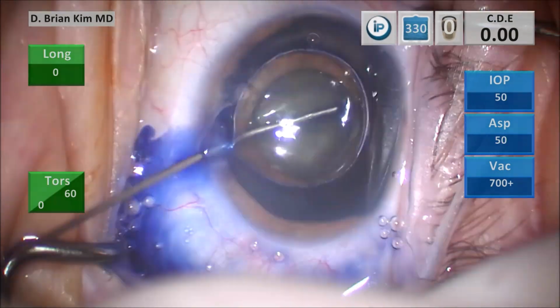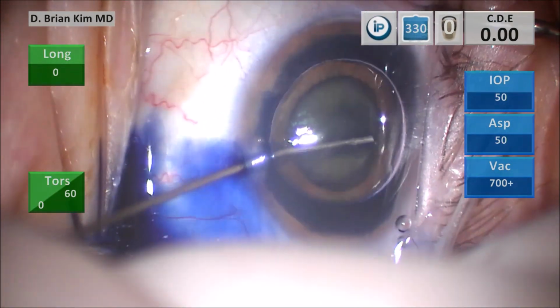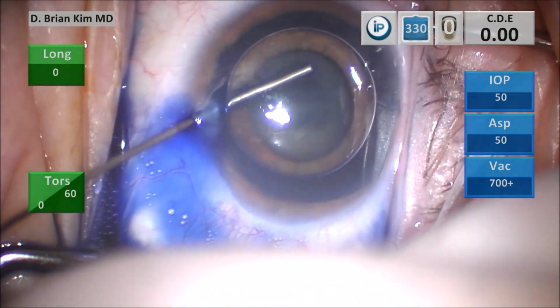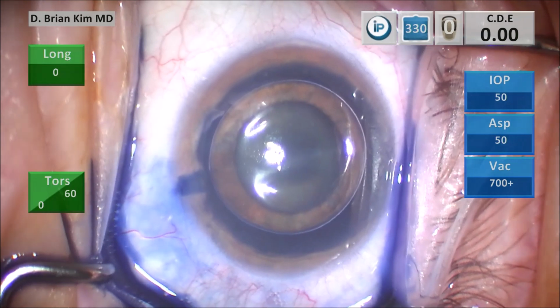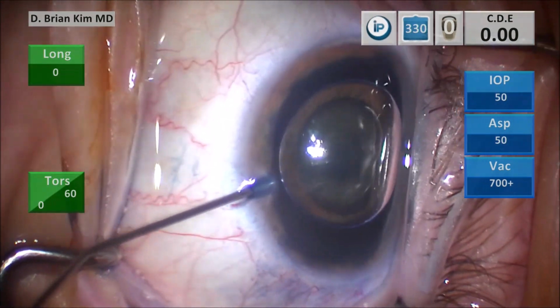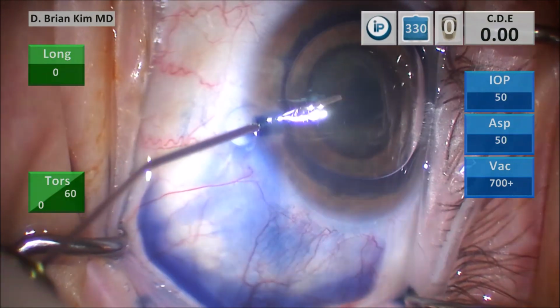Whenever there's a dense lens like this, it pays to put trypan blue in just in case you have trouble finding the rhexis. In case you have an anterior capsule tear, you'll be able to more easily identify that. And also, if you have to put iris hooks in, you'll be able to identify the rhexis edge better.